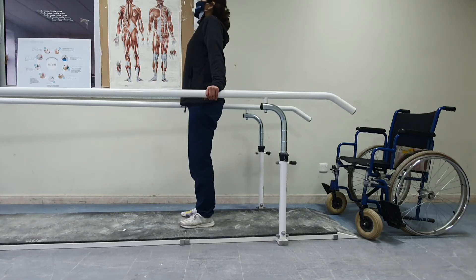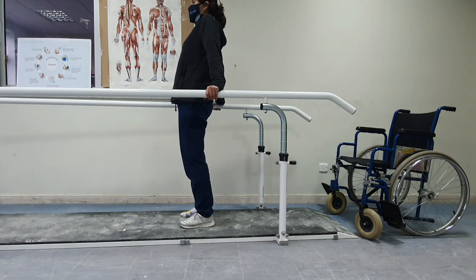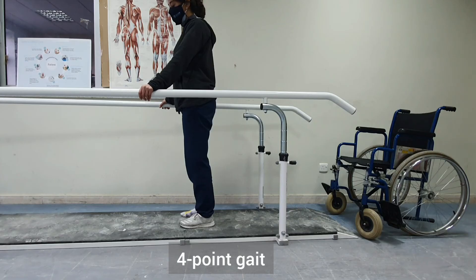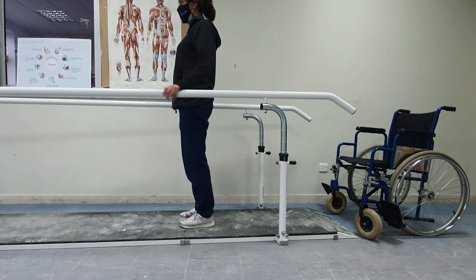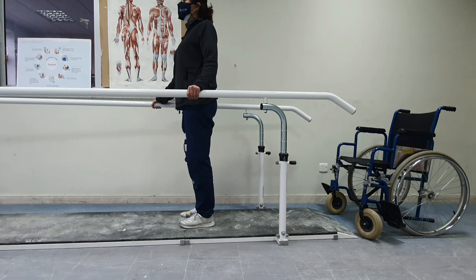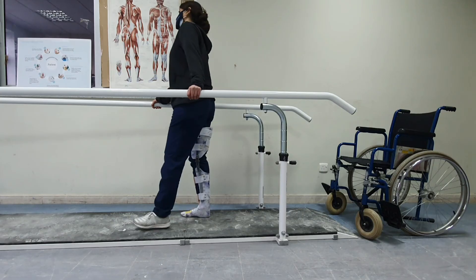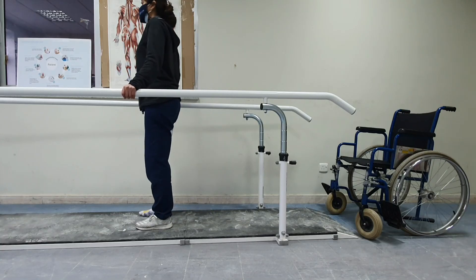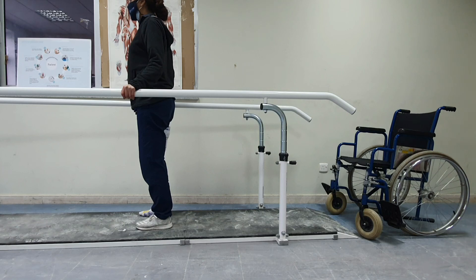Now we will start gait training patterns. We begin with four-point gait because it is the slowest but most stable pattern. With four-point gait, the patient moves one arm forward, then the opposite leg forward, then the other arm, then the other leg. It is very slow but a very stable gait pattern to start with.